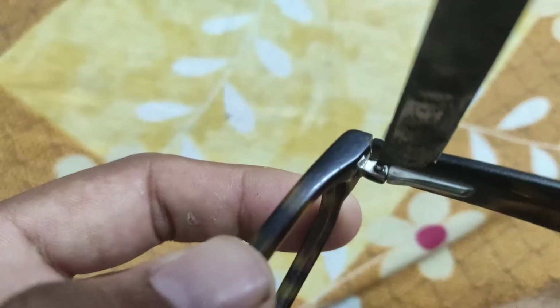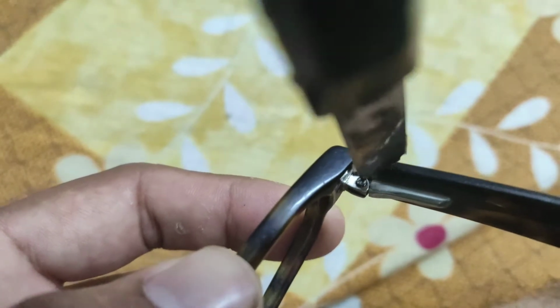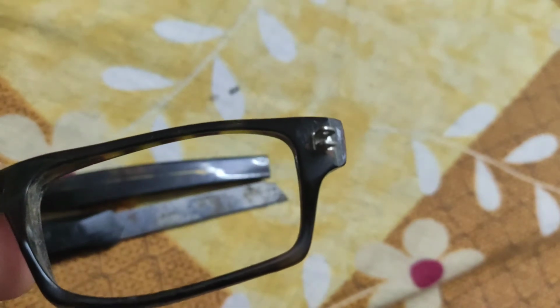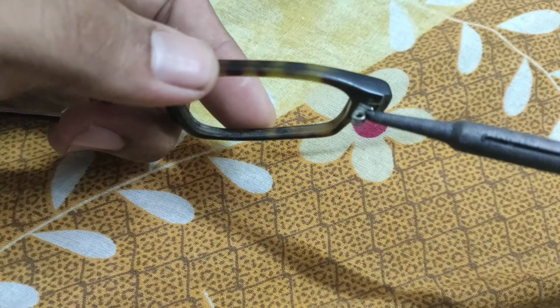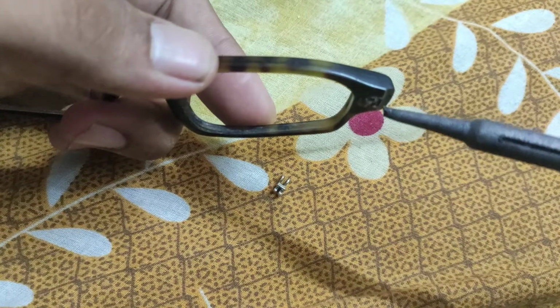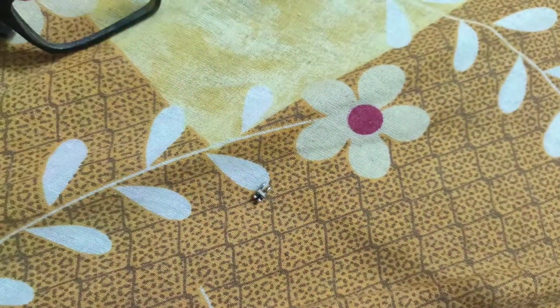You have to unscrew it from the old one, so you will get it like this. Now you have to take it out by using a soldering machine, or you can heat a metal and keep it for some time. It will come out after some time. You get this hinge. Now you can fix it.